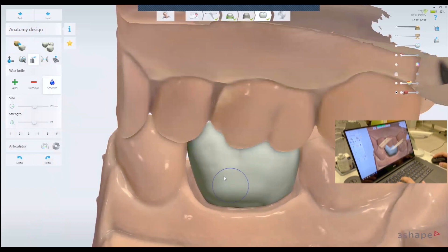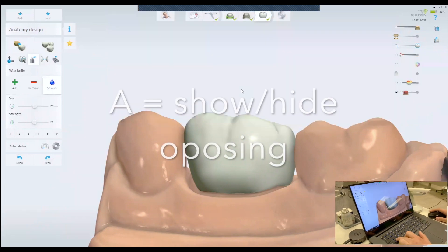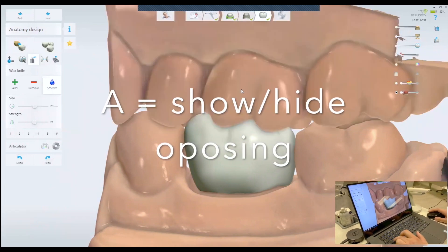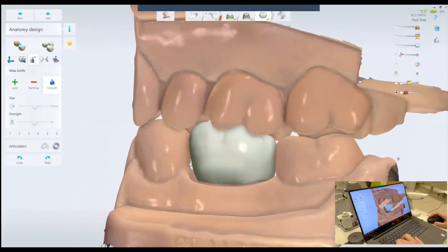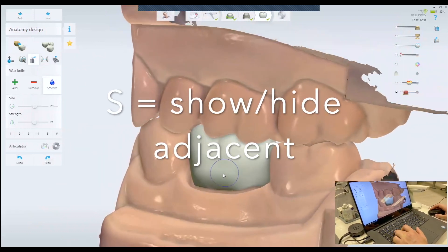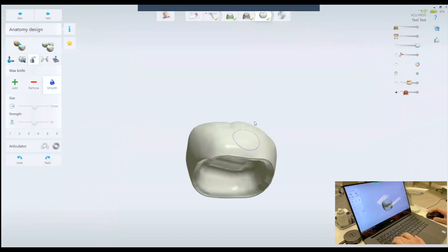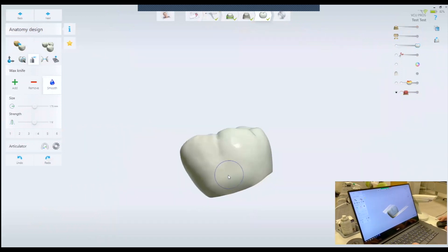If you want to show the upper — the upper is the antagonist — the shortcut button is A. The adjacent teeth shortcut is the S button. So if you want to hide the adjacent teeth, just click S. I'm going to hide both just to show you what I'm going to do with the wax knife.